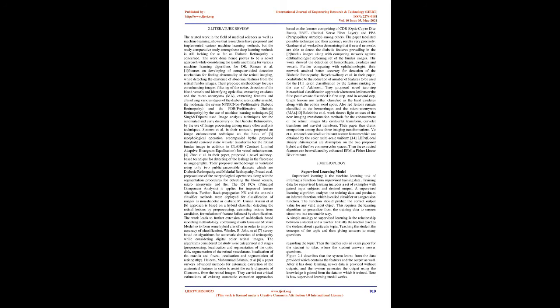Their proposed methodology focuses on enhancing images, filtering of the noise, detection of the blood vessels and identifying the optic disc, extracting exudates and the microaneurysms, extracting features and classifying various stages of the diabetic retinopathy as mild, moderate, severe NPDR, non-proliferative diabetic retinopathy, and PDR, proliferative diabetic retinopathy, by the use of machine learning techniques. Singh and Tripathi used image analysis techniques for the automated and early discovery of the diabetic retinopathy, by the use of image processing among many other analysis techniques.